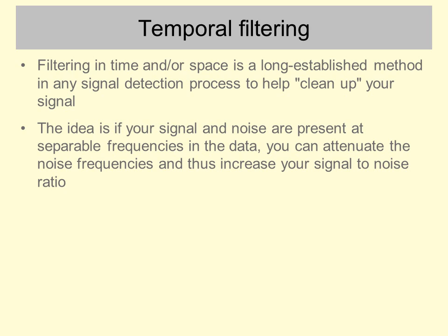So think about your experimental design as if it were something that oscillated, or a periodic thing, a sine wave. If it's a simple experimental design, we'll have a clear repeating pattern in time. Now, other sources of variation in the bold signal might vary more rapidly than that, that is, be a higher frequency sine wave, or they might vary much more slowly, that is, repeat much more slowly than the ups and downs of your experimental time course, and so those would be low frequency signals.